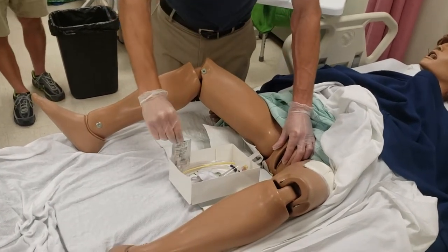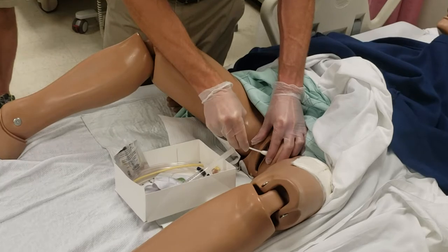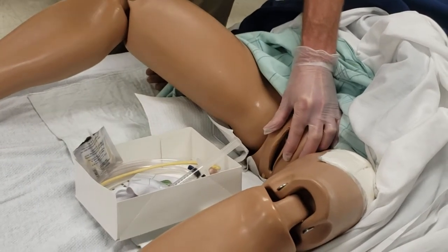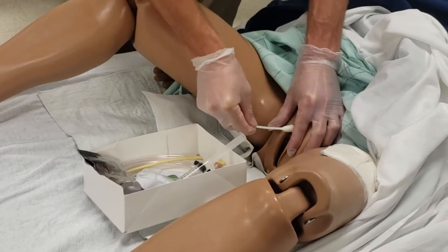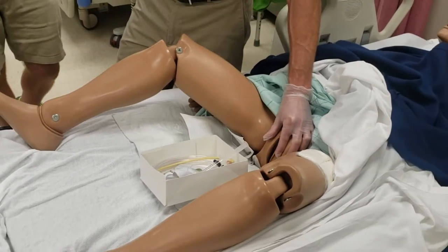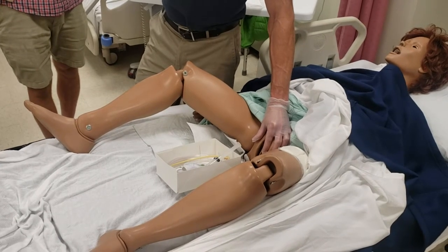I'll give you an analogy for how to find the urinary meatus in a second. Grab my swab stick. I'm going to do the far labial fold front to back, near labial fold front to back, and then down the middle over top of the urinary meatus front to back. I've already done normal perineal care, so there should not be fecal matter, exudate, or drainage. At any point once the swab stick has touched, if the labia come back together, I'm starting over.